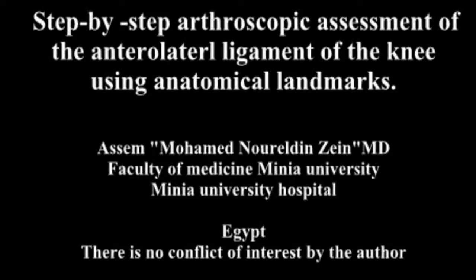I would like to demonstrate a step-by-step arthroscopic assessment of the anterolateral ligament of the knee using anatomical landmarks. With the patient supine and viewing through a high anterolateral portal, various forces are applied to open and examine the lateral compartment.